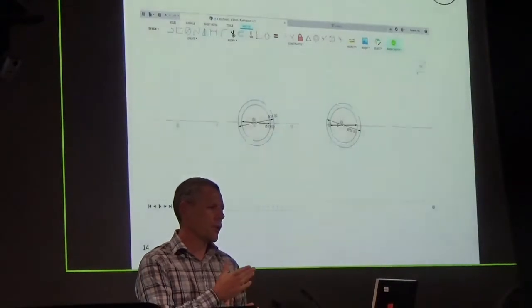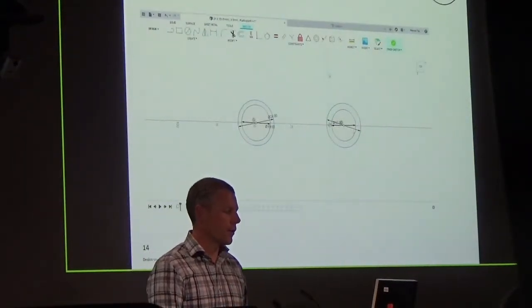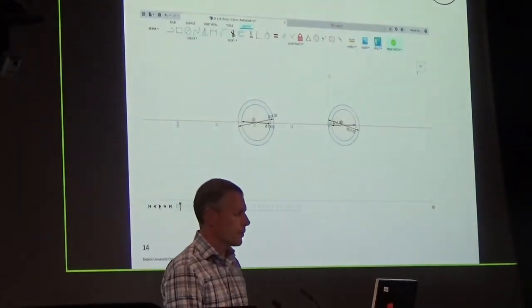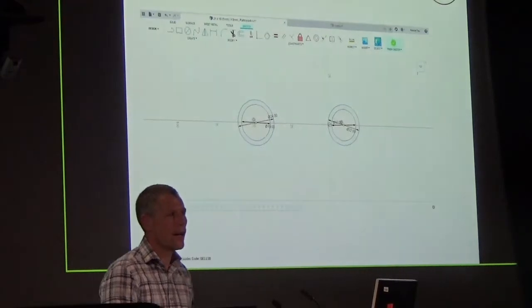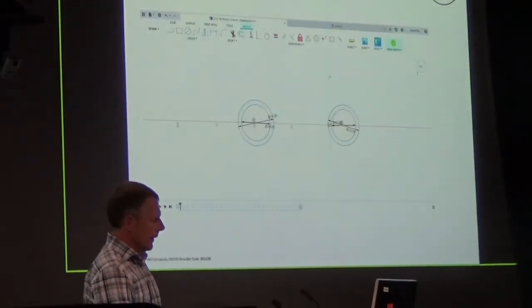So it just shows that in terms of the process of modifying a splint that we've created, you don't need to go through the whole design process from start to finish. You can actually just modify a small part of it that then flows through.